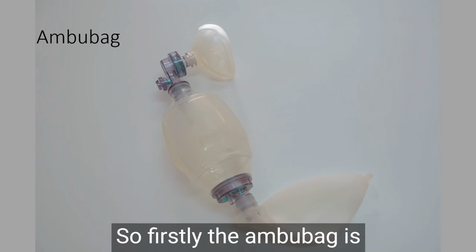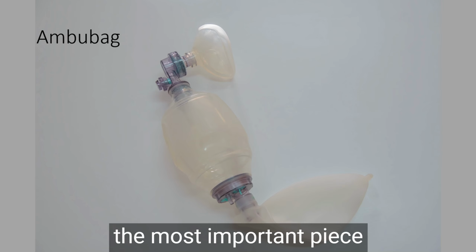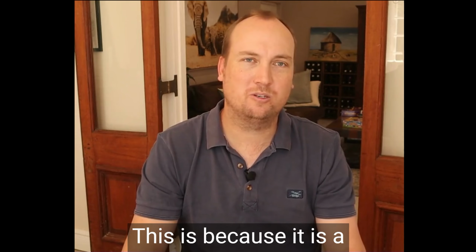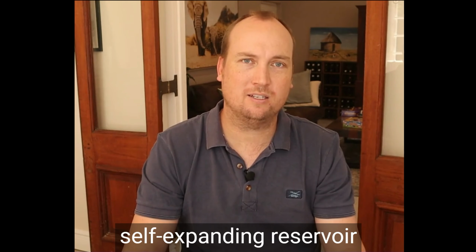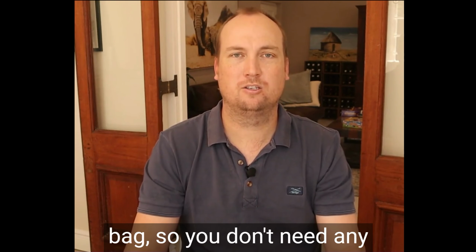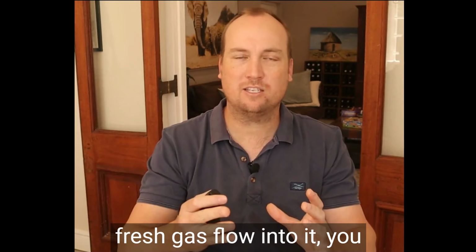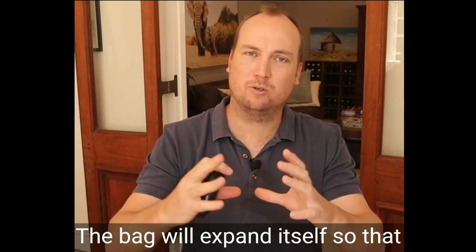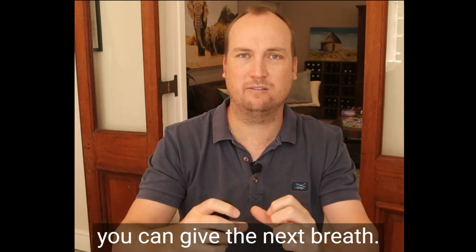So firstly, the ambu bag is the most important piece of ventilatory equipment in the hospital and in theatre. This is because it is a self-expanding reservoir bag. So you don't need any fresh gas flow into it. You don't need any external gas. The bag will expand itself so that you can give the next breath.